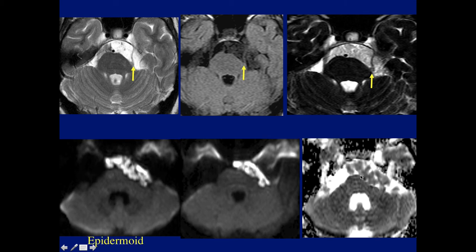And this was an epidermoid, an extensive epidermoid encasing the trigeminal nerve and causing its atrophy. The problem with these lesions is that surgically they're very difficult to remove because of the nerves that course through them, like in this case the trigeminal.